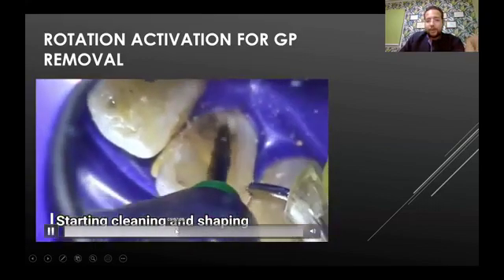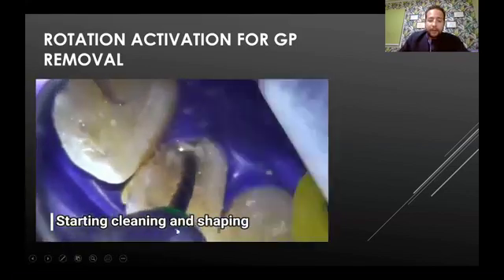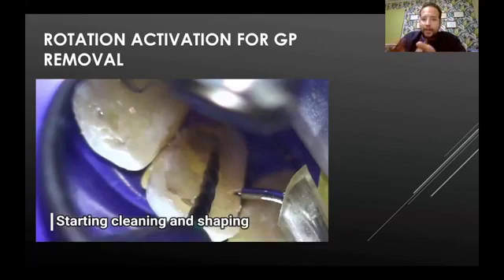Look, the green rubber stopper. This is shaping to full working length with the 35.04 file. But still here I like to use AF Max or XP Finisher, or rotation activation in general in retreatment, because the canal is oval. Your file will clean in a round motion, in the round area of the canal, but in the oval part of the canal, with this difference between oval and round shape, there will be two sides that the file will not touch. That's when AF Max and the XP Finisher, the rotation activation, come in very handy to remove gutta-percha and sealer.